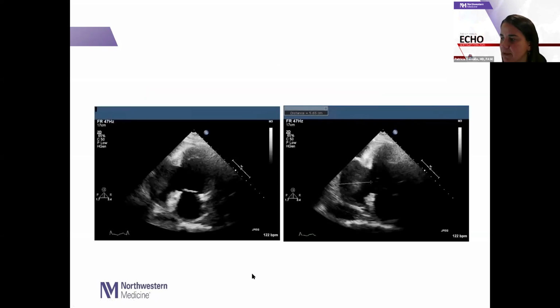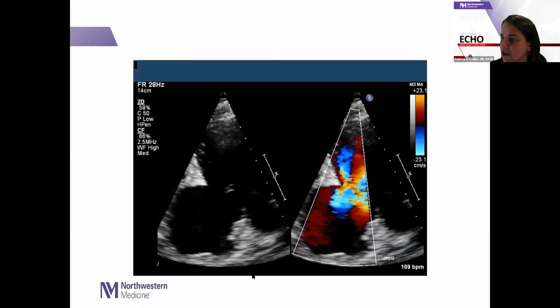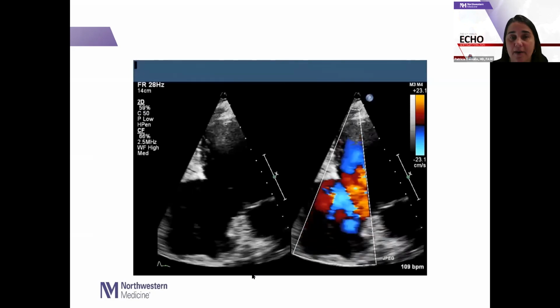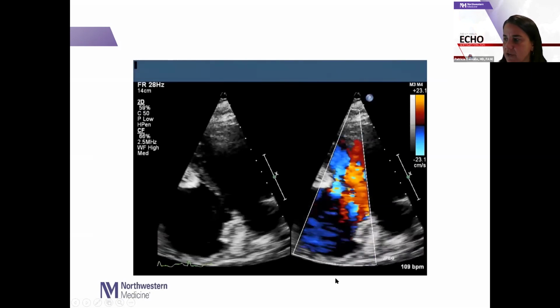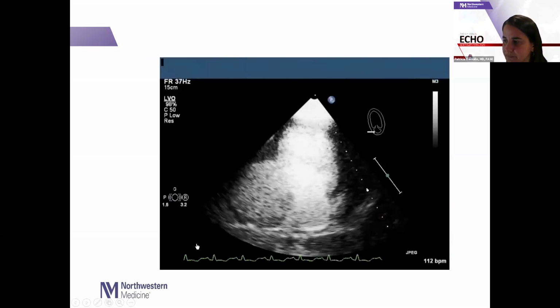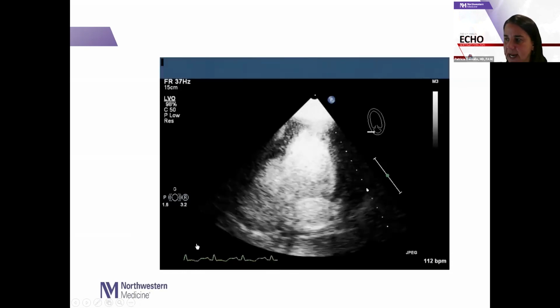Here is the apical 2-chamber view, and you see a large pseudoaneurysm there. Here we use color Doppler, which is often referred to as the cheap man's contrast echo, but you can see that the color Doppler, although it's set at a low signal, you don't get opacification of the entire aneurysm. And so it's unclear if there's thrombus there, but after evaluation with echo enhancing agent, you see that there is no thrombus, and this patient was emergently taken for surgery and had a good outcome.